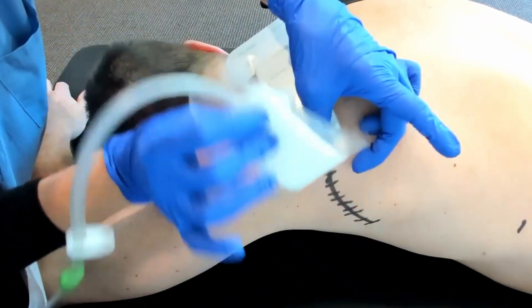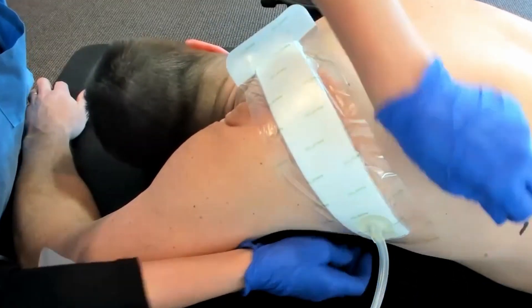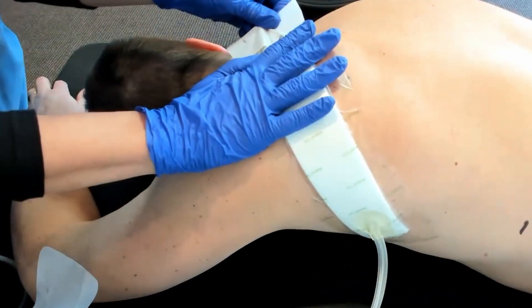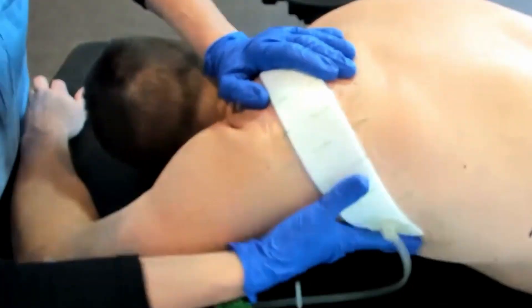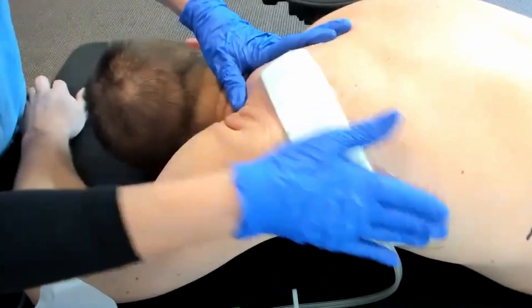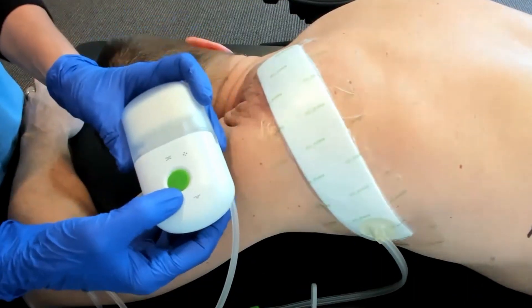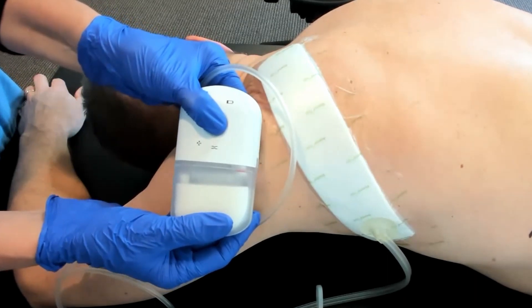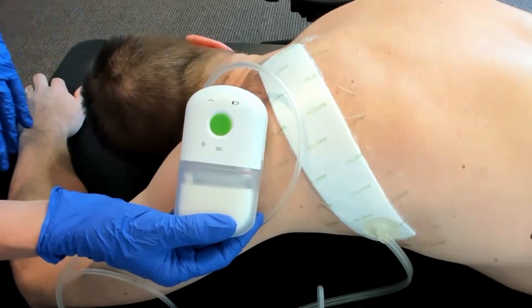Once you have it on, I always like to give it a little bit of love — really press it down nicely. Obviously you're going to want the patient's skin nice and dry before you put this on. Then you start the pump by pushing this button and holding it for two seconds. You can hear it, and it'll give you those little flashes — it'll flash twice once it achieves its seal, so you know it's working.